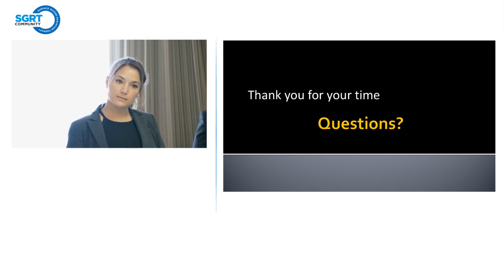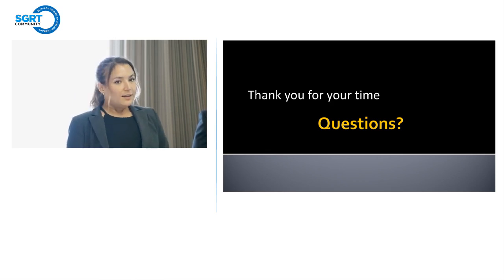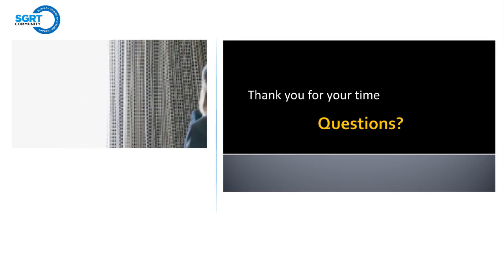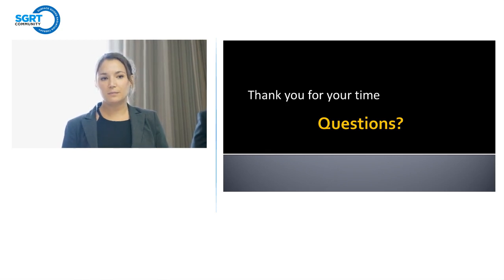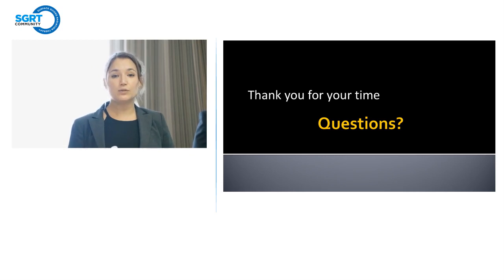Mm-hmm. Do you feel like, I mean, I know your study was just to see that reduction in cone beams, but do you feel like your policies may change because now having this technology and being able to use it, that'll go down or increase, or you'll have any other changes just because you have it in place now? I think for now, just getting away from the orthogonal KVs is going to be a huge step. Reducing the actual threshold might be a bigger issue to bring up, but we really have seen that we don't need to take as many cone beam CTs now that we're setting up to the surface.